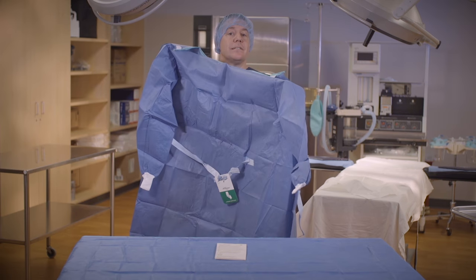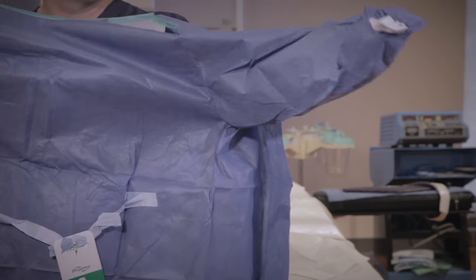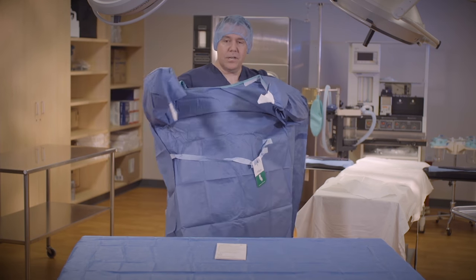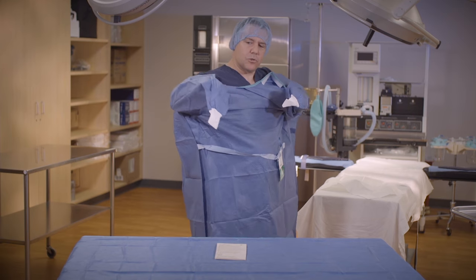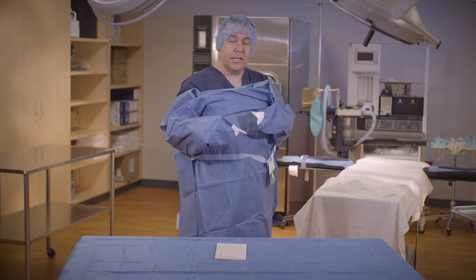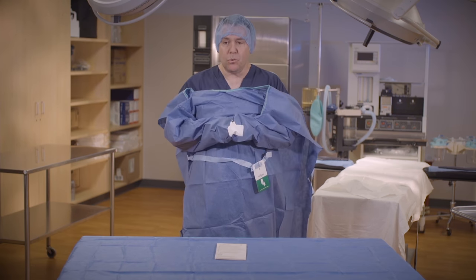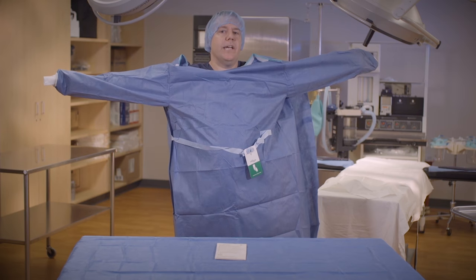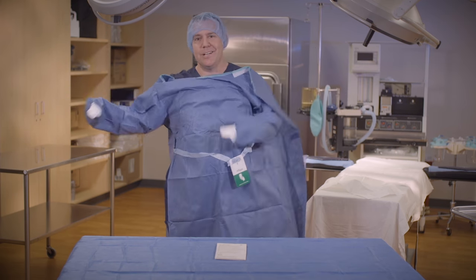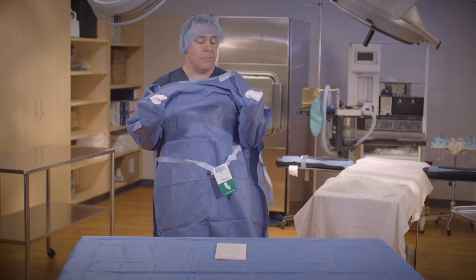I'm going to grasp the top of the gown near the neck and gently unfold the gown. I'm going to place my hands inside the gown, inside the sleeves, and extend until I reach the sleeve cuff. I like to tell my students it's like swimming — I'm swimming forward. This keeps us always facing our back table. I've actually seen scrub techs who swim the other way and hit IV poles, hitting their circulator, doing all sorts of things. So always go forward with your gown. Now I'm in my gown. My fingers are behind the white cuff. I'm going to glove.